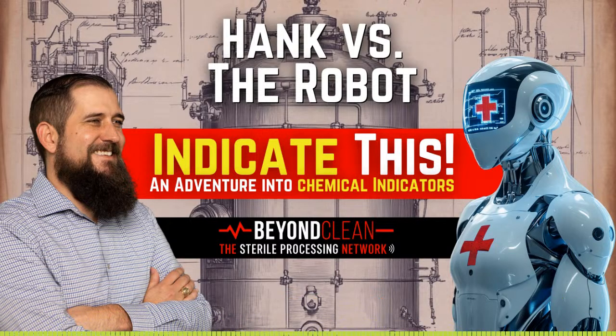Three, routine maintenance and calibration. A world without indicators would demand near-perfect adherence to equipment maintenance and calibration schedules. Every sterilizer would need constant validation testing to ensure it performs as expected. The risks of eliminating indicators.